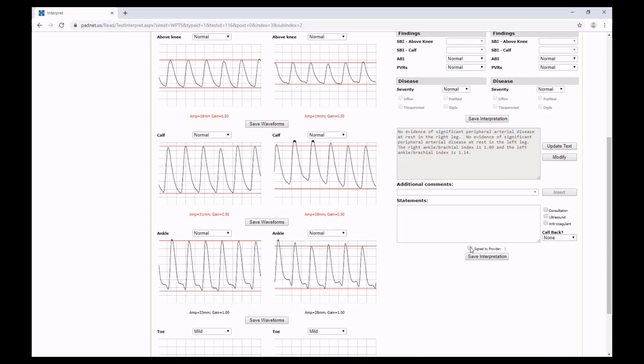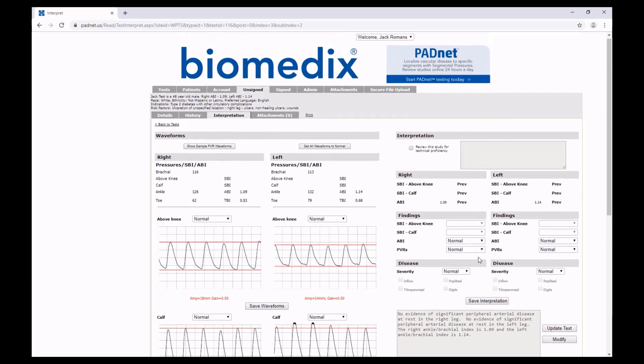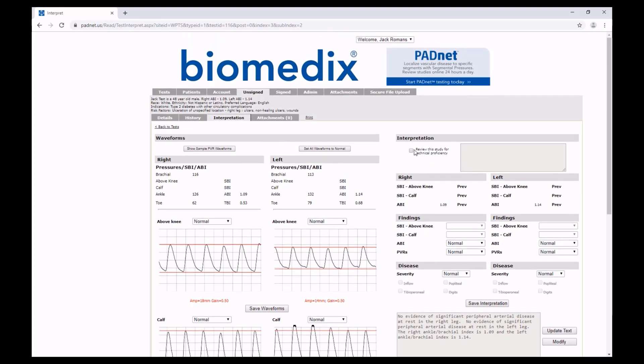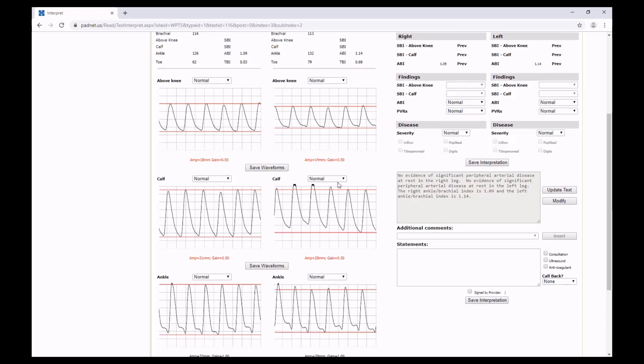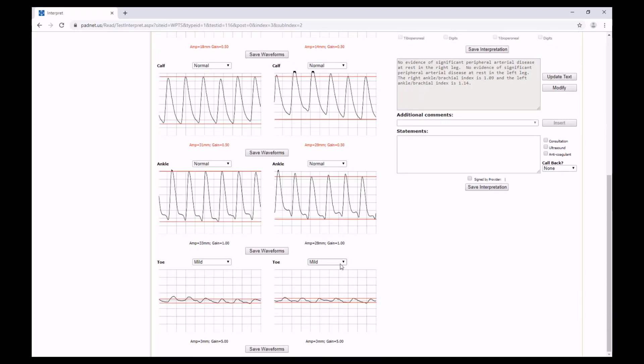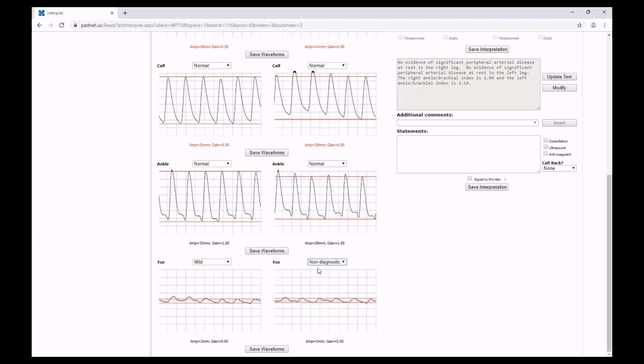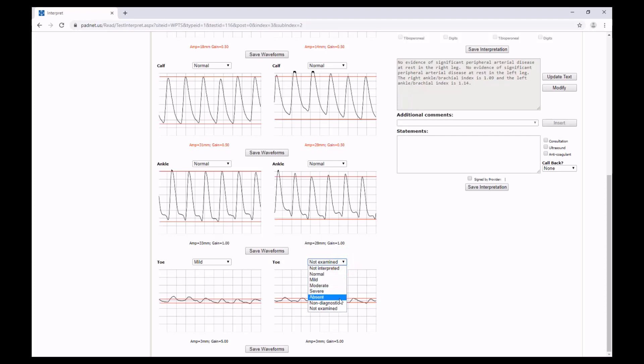Lastly, from here, you will want to sign it by checking this box and then clicking Save Interpretation. If at any point you wish to notify both Biomedics and the test site of some abnormalities in the performance, check this box right here. Let's say you're looking at a waveform that you cannot interpret. It is important that you select Non-diagnostic. If you select Not Interpreted or if you select Not Examined, the test will not let you sign and submit it, because Not Examined indicates that you will eventually examine it. So Non-diagnostic is the result you want to select if you cannot interpret a waveform.